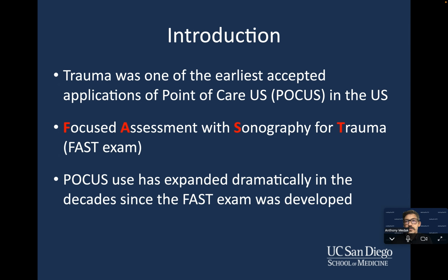So by way of introduction, in terms of clinical practice, I am an emergency physician, and so is my co-director, Dr. Elaine Yu. And years ago, before either of us were even actually in practice, trauma was amongst the first accepted applications of point-of-care ultrasound, or so-called POCUS, in the United States. And that was done primarily in trauma centers and in the emergency department.